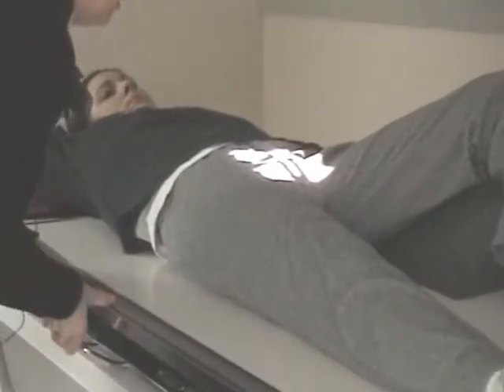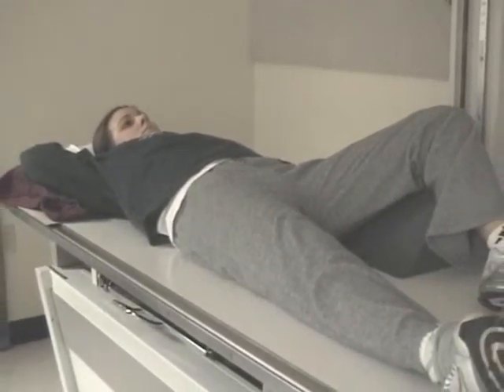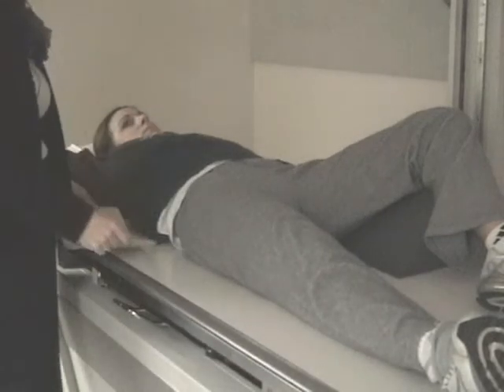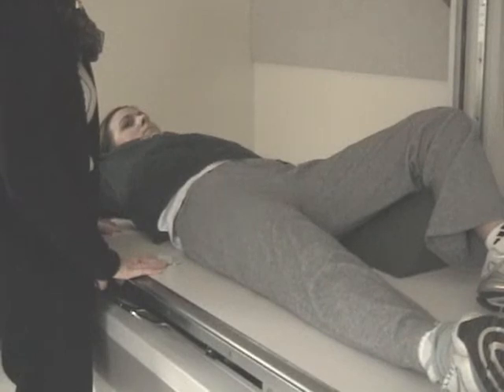Okay. Now, to center the patient, you're going to use some landmarks. And you will recall from your reading that you're going to use the ASIS and the superior border of the pubic symphysis, or the upper border of the symphysis pubis. Two different ways to say the same thing.